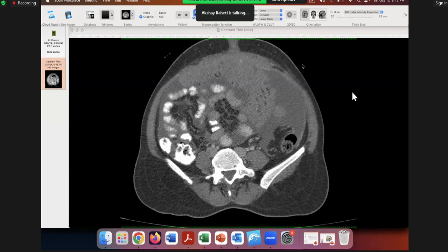Okay, Asad is asking, do you use oral contrast for staging C ovary? That's an excellent question, and the answer is yes, you always do it. So C ovary, and that's one thing I didn't show you actually, maybe next time I can, has also a propensity for, let's say, two more things. One is abdominal wall deposits, and one is serosal bowel deposits.